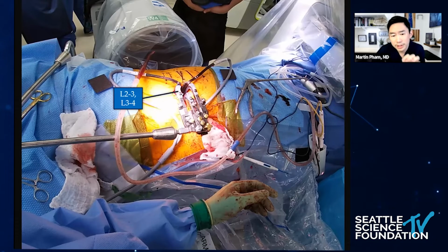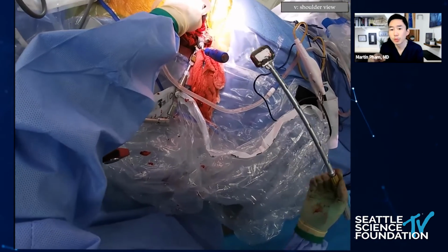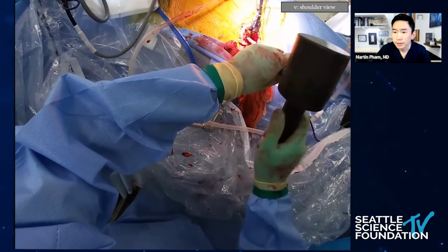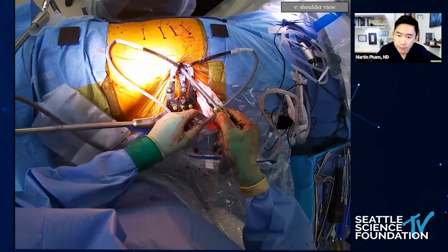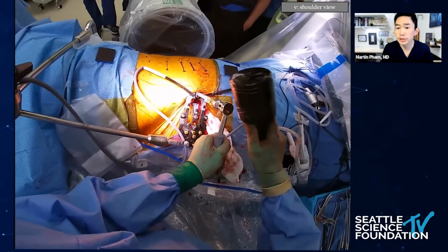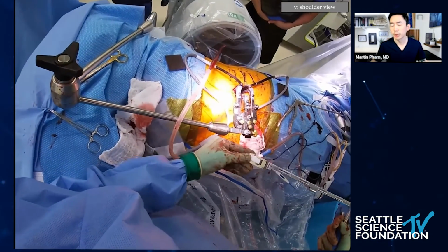So here you have the incision for L2-3 and L3-4, and then you have here the incision for L4-5 and L5-S1. So with this video, this is the L5-S1 cage going in first. And again, you really see the benefits of lateral decubitus positioning. So although you give up a lot of things, as Dr. Hines has talked about, the ability to put in cages from L5-S1 all the way up is a really powerful way to keep lateral decubitus positioning still in your technical armamentarium.